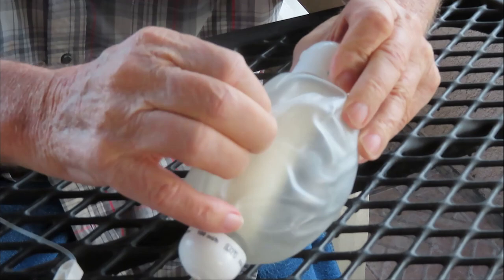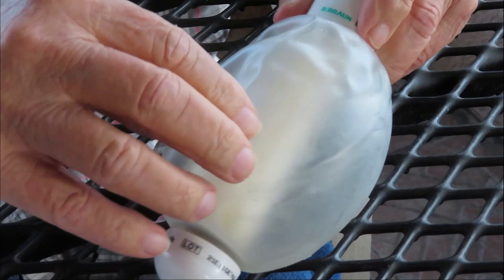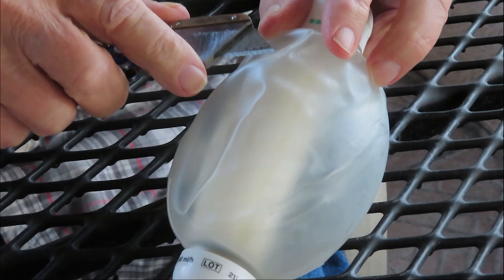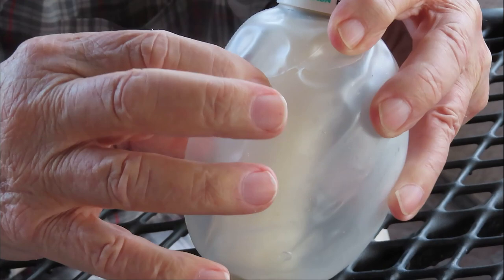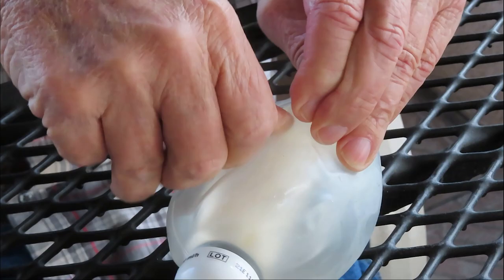And the way that I think it works, which I don't know, you have a bladder inside that's filled with the liquid. This bladder outside, which isn't full completely, just holds it there so it doesn't get any bigger than that. There's no pressure in that at all. So out of curiosity, I'm going to poke a hole in it. Okay, here's the outer side right here. As you can tell, got a hole, no pressure. This one in here is tight, extremely tight to be exact, that bag. So that's where the medicine's located. So this is like a protection bag.